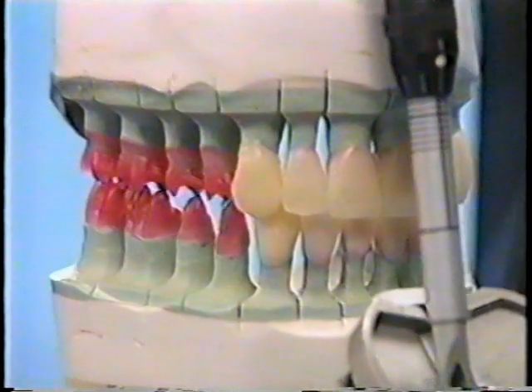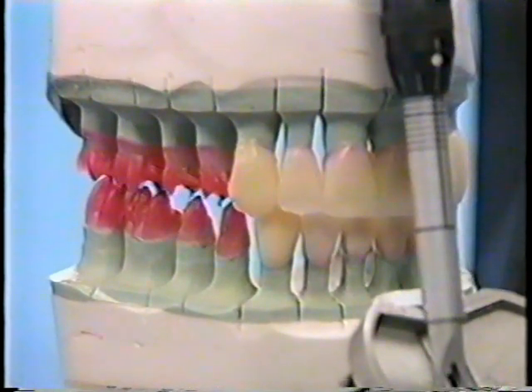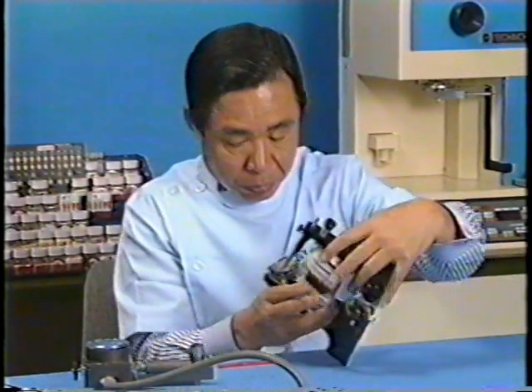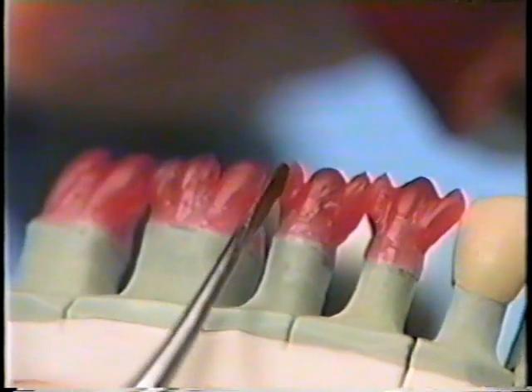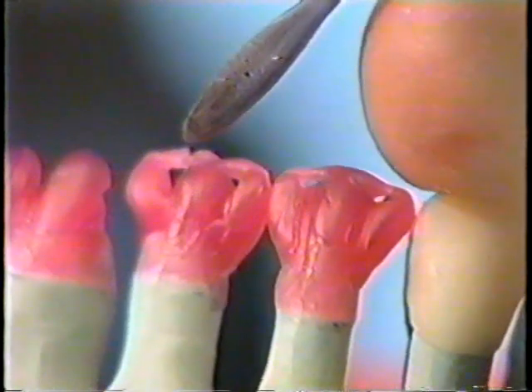We'll also check for lateral movement toward the balancing side. Next, we'll establish the distal and mesial line angles relative to the alignment of the antagonistic and adjacent teeth.